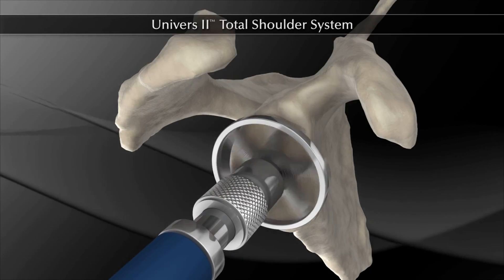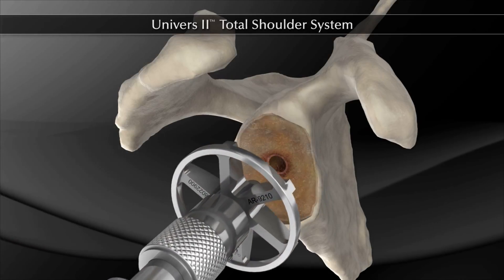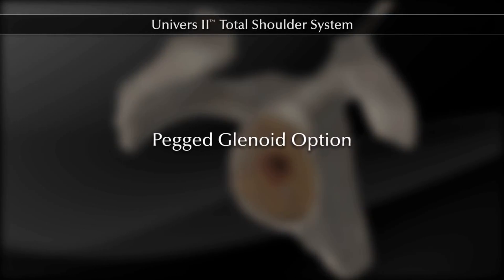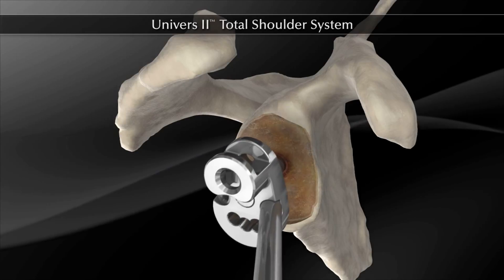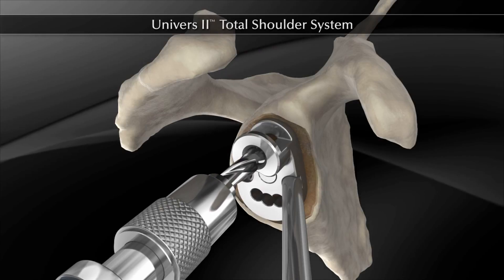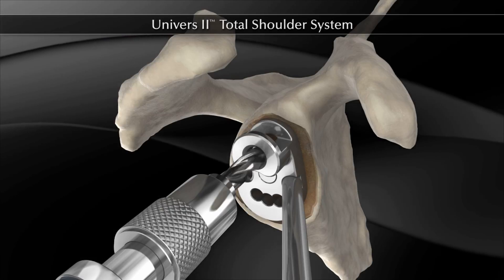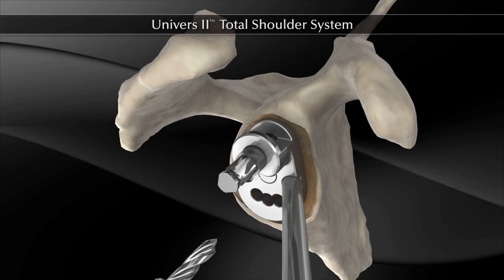If desired, it is acceptable to ream up from the small glenoid reamer to the reamer corresponding with the chosen glenoid implant size. The pegged glenoid number two guide is moved into position by engaging the posterior peg into the previously drilled peg hole in the glenoid. The short or long 6 mm drill bit is positioned into the reamer quick connect adapter and the superior peg hole is drilled. The drill bit is detached and left in place.